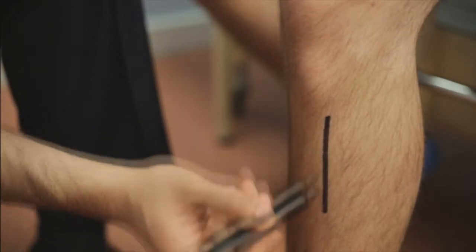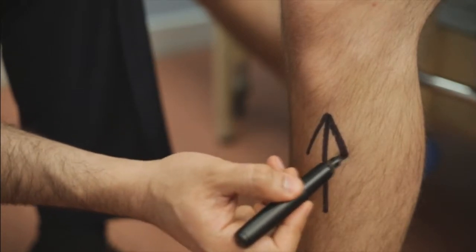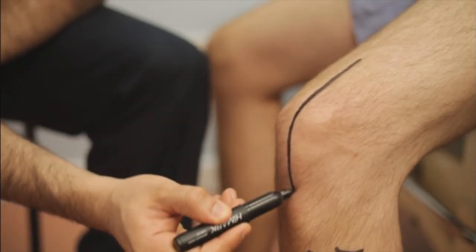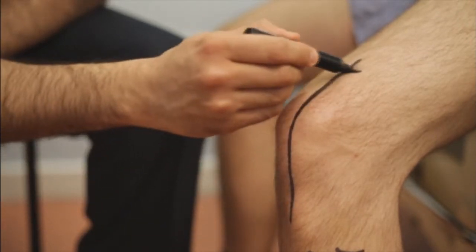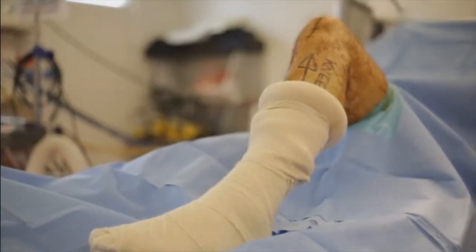You'll be admitted to the hospital on the same day of your operation, and your surgeon or a member of the team will see you. A mark will also be placed on your knee. Prior to starting the operation, whilst under anaesthetic, a tourniquet is placed around the upper part of your thigh to make sure the operation involves minimal blood loss. Your skin is prepared with an antiseptic liquid, and antibiotics are given to help prevent infection.